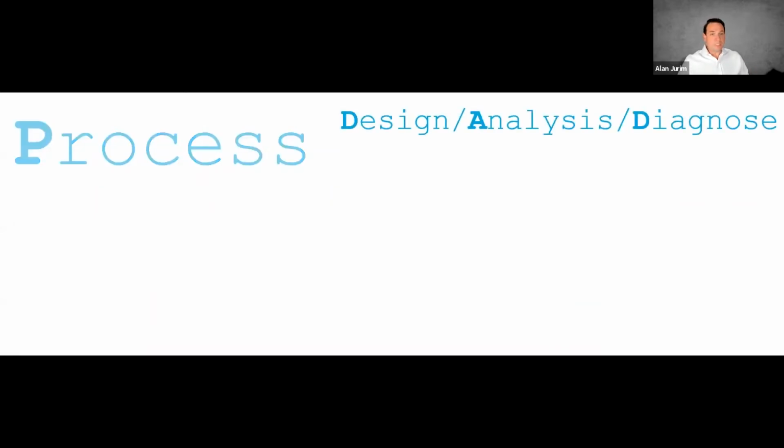And next, we want to process that data, because really the idea of processing data is where the value comes from. So we can use that data to do a design. We could design a crown. We could analyze data. We could take a scan from a patient 10 years ago, a scan from today, and compare them and use that to maybe help us diagnose.